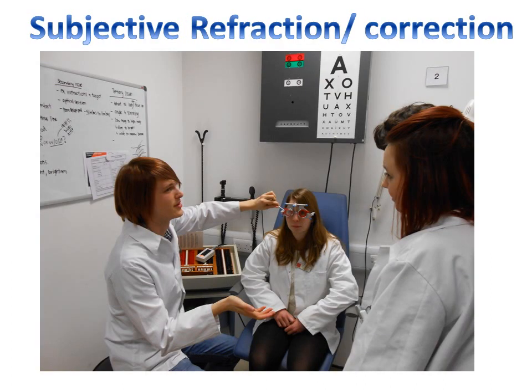Subjective refraction: you have done an objective examination and you have calculated the power. Now you are occluding each eye and testing the other eye by putting your objectively calculated lens, to check whether the patient is subjectively accepting the same lens. Normally there will be a slight variation of plus or minus 0.25 from the value which you have calculated, or many a time, if your calculation is extremely good, then it matches exactly with your objective examination. So if the subjective and objective examination powers are the same, then it means that the retinoscopy done is almost perfect.